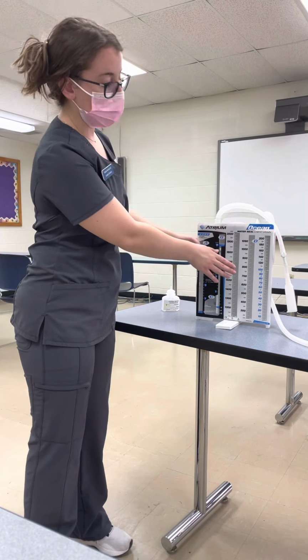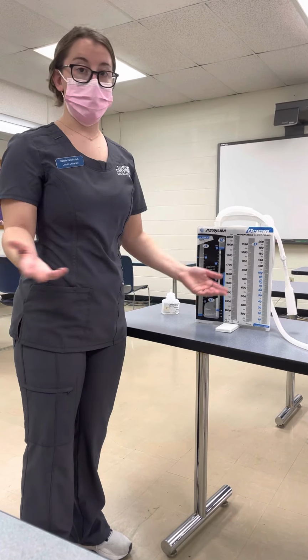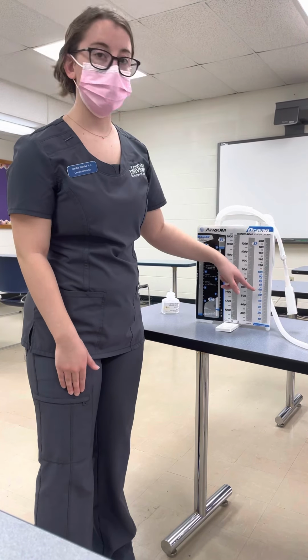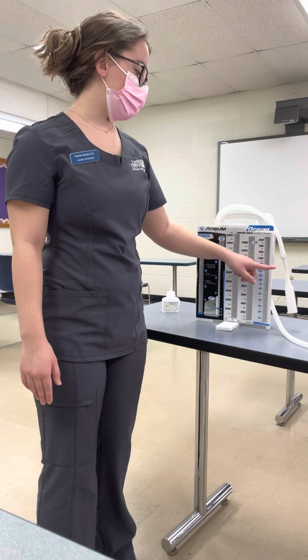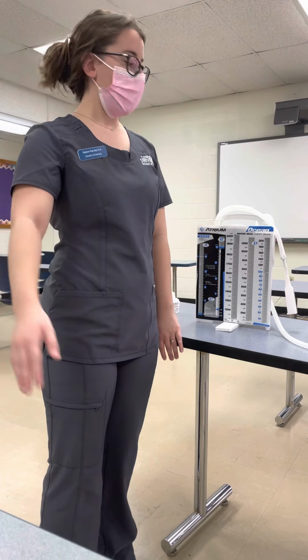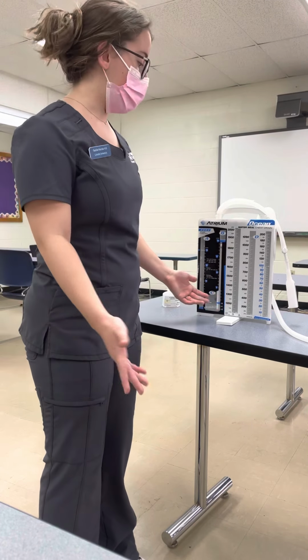Our collection chamber is simply the output that we get from the actual chest tube drain itself. So it'll be the amount of blood in this case, and it'll fill up here, and each shift, every 8 hours, we will mark this with a line indicating where the drainage is at, and date, time, and initial it so that we know how much output has happened in the last 8 hours. If we see that our output is more than 70 mils per hour, that is cause for concern, and we would want to notify the provider immediately.